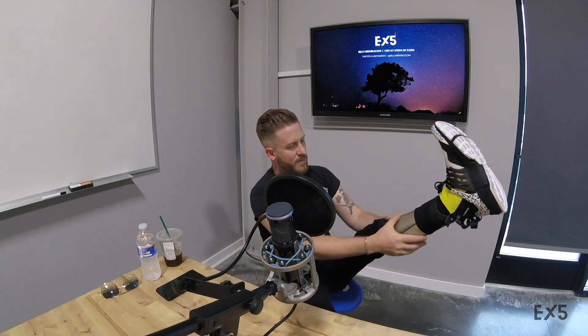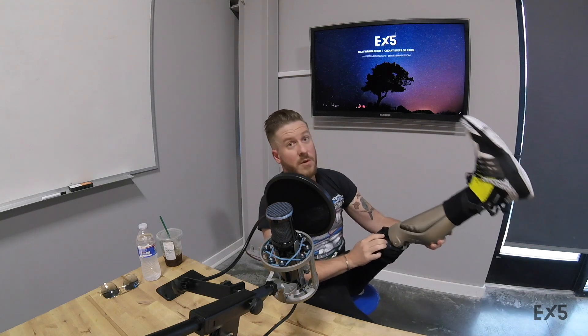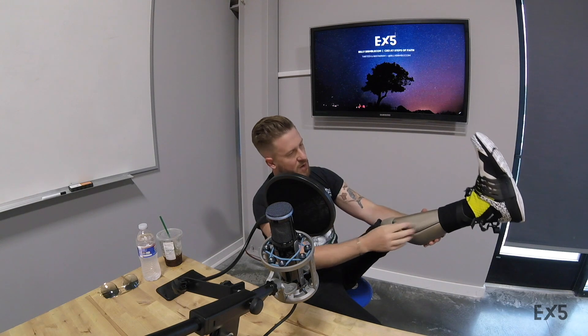It's kind of like a gel sock and then the socket goes over that. I do not - I never have. I am a skin-fit suction socket. The socket is two layers: there's a flexible plastic and then over that there's carbon fiber. Can we see this? Yeah, throw that thing up on the table.